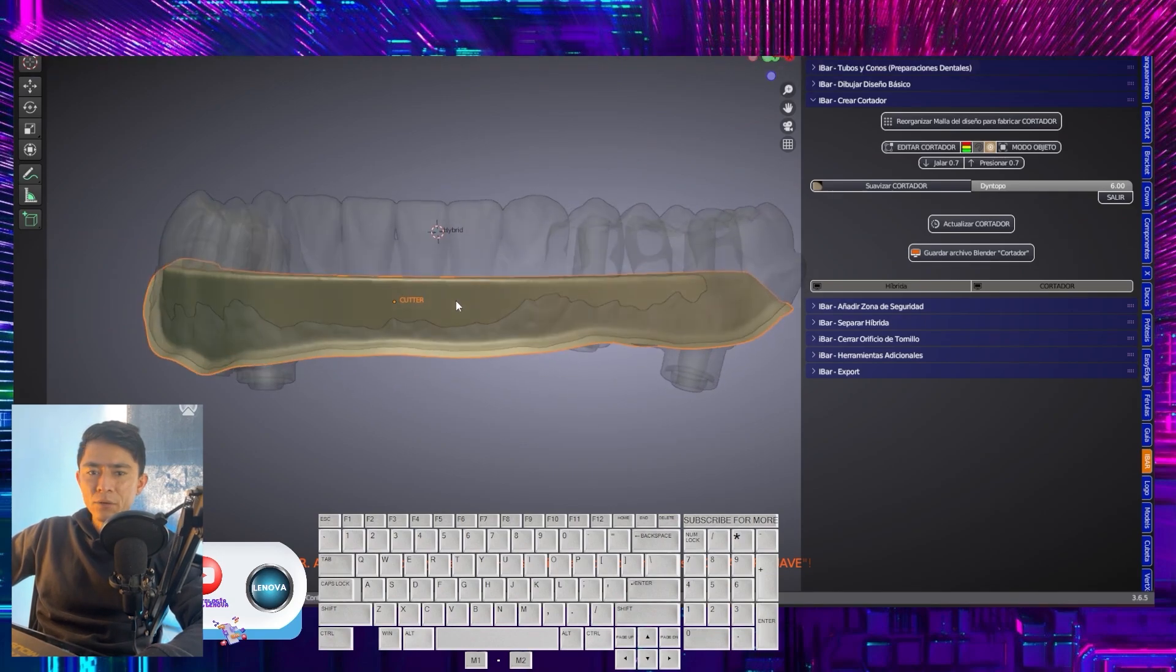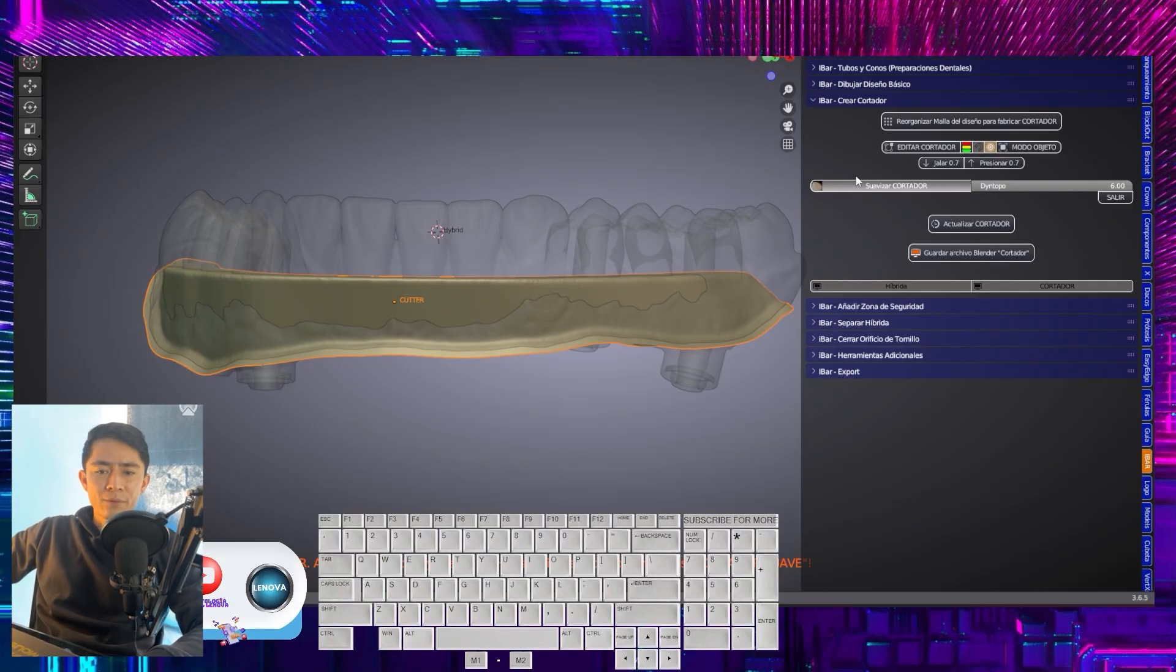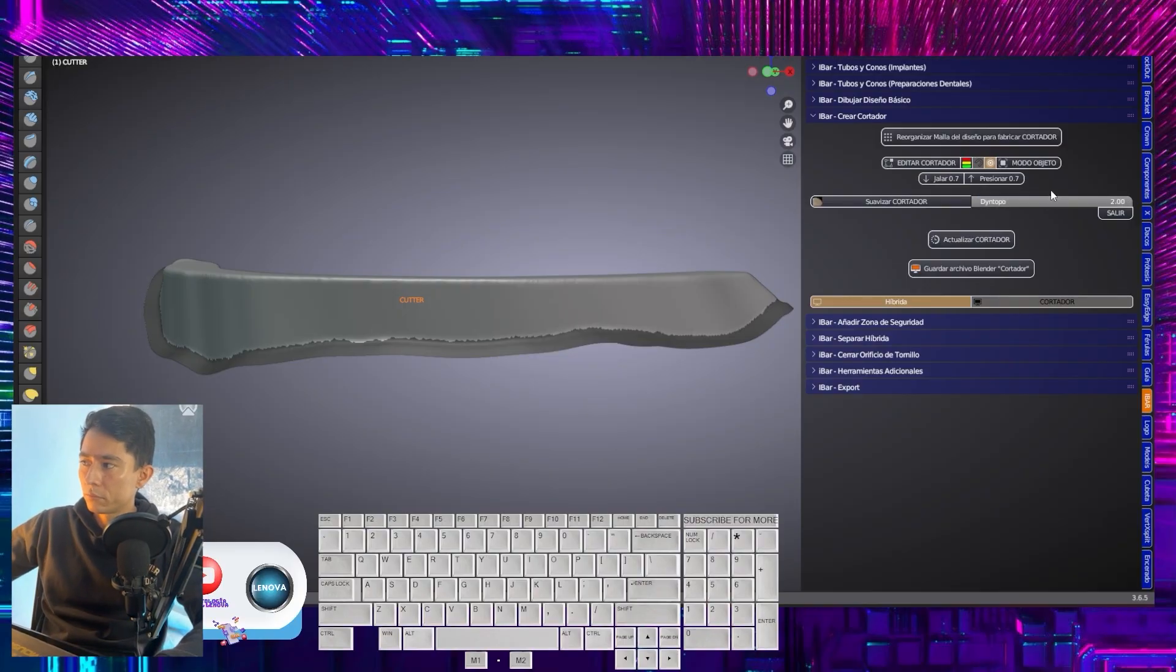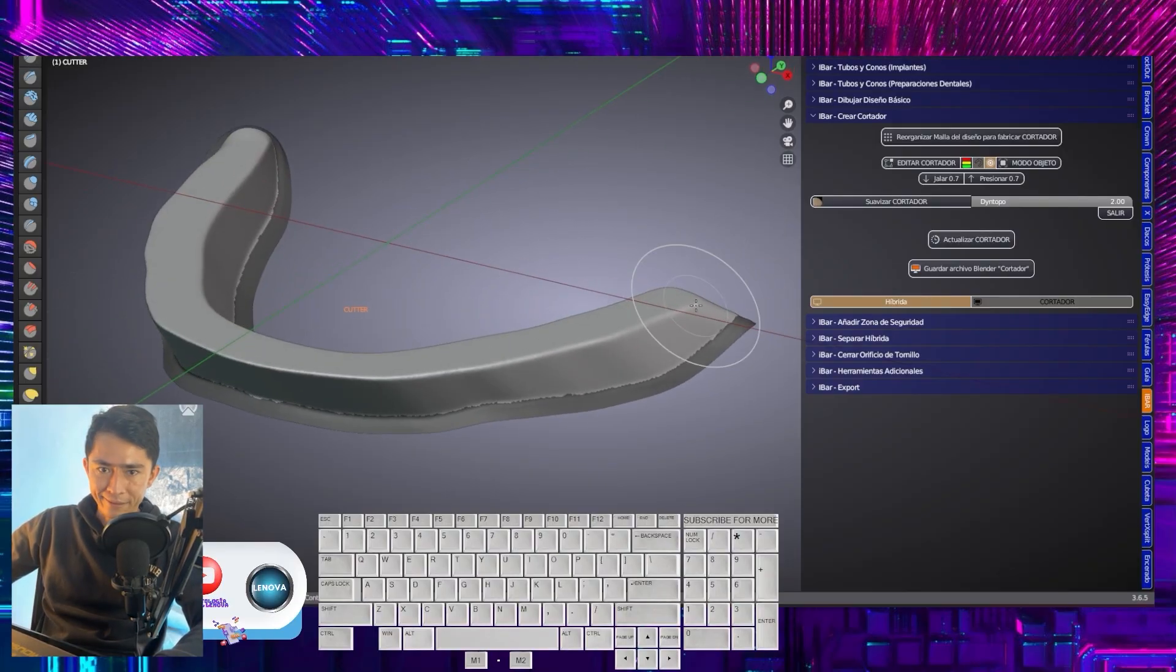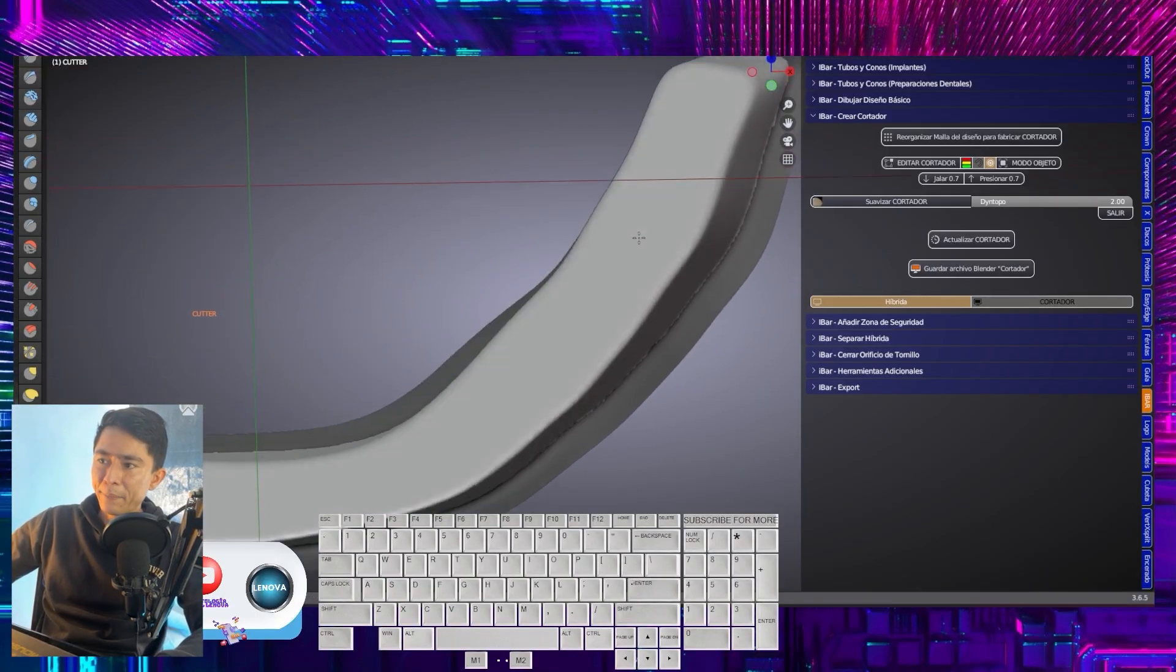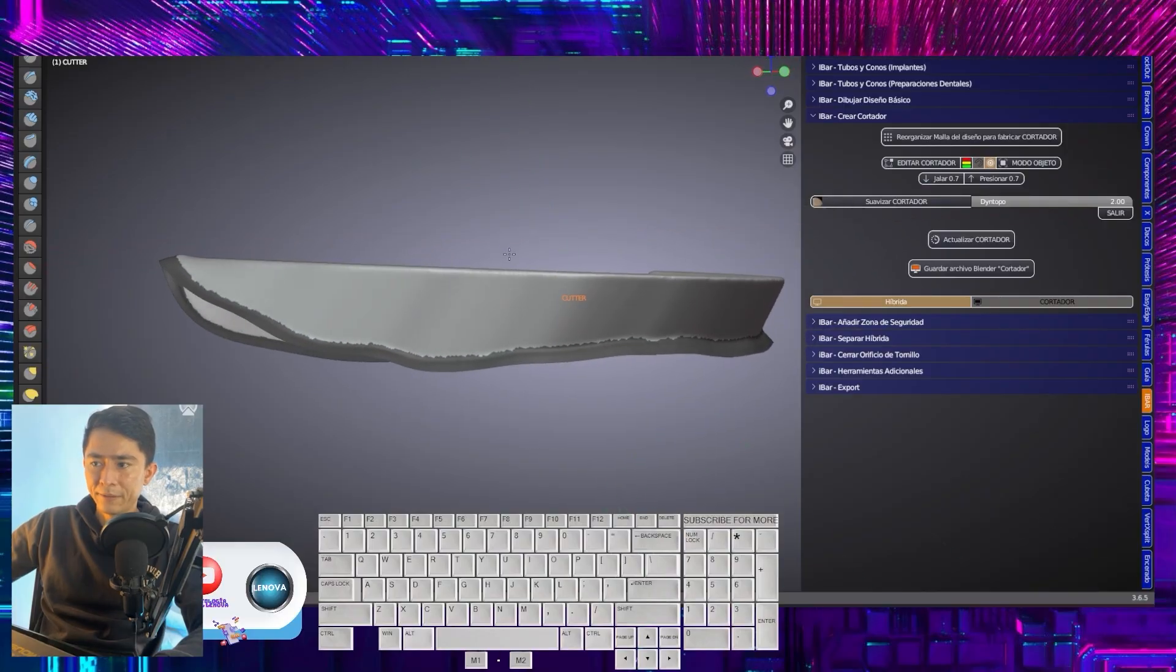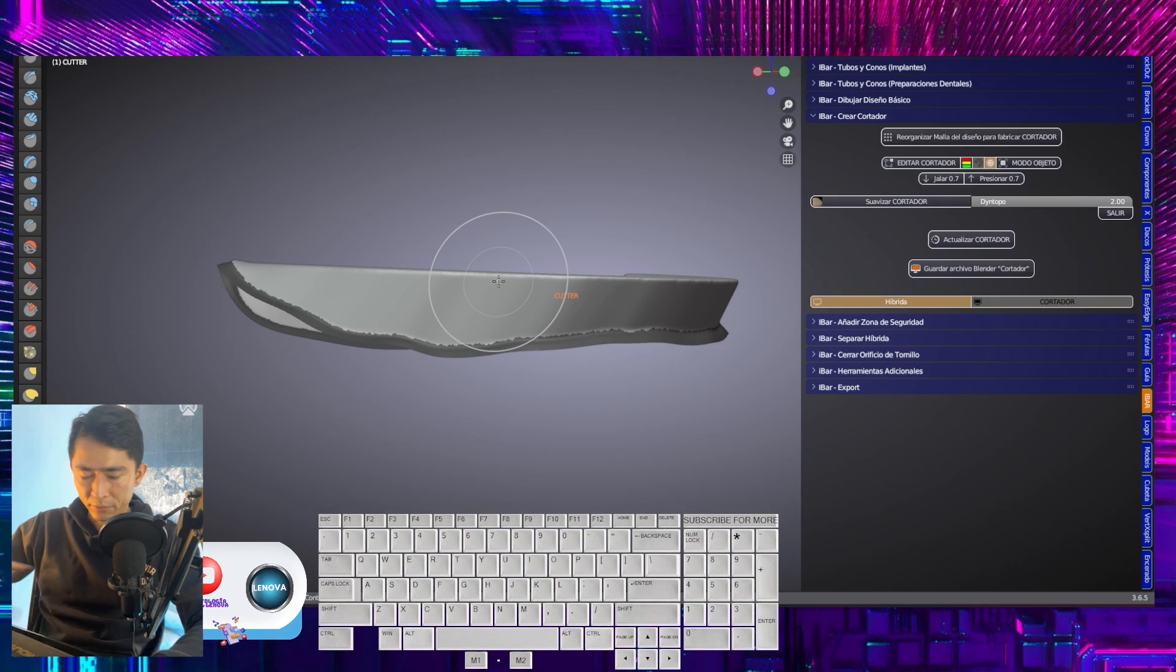Now, here we are going to do something very important. We are going to smooth. Notice that the bar is selected. I select smooth. Then I will change the smoothing voxel. I will set it to 6. I will lower it to 2. And I will start smoothing from top to bottom, removing first 90 degree flanks, second areas that might interfere with the reinsertion of my superstructure. So I'm going to smooth. I'm going to create the design that I normally work with for all my cases.